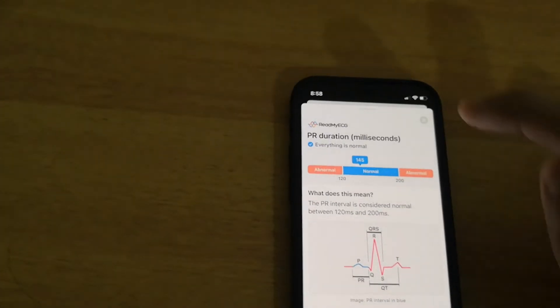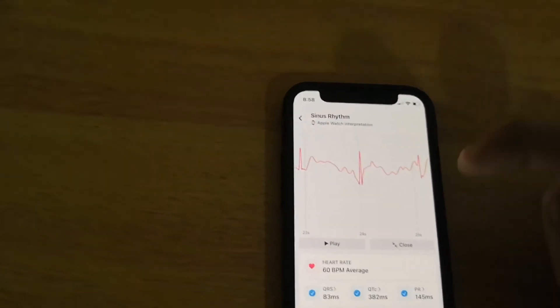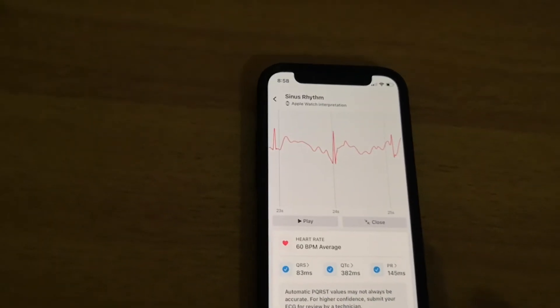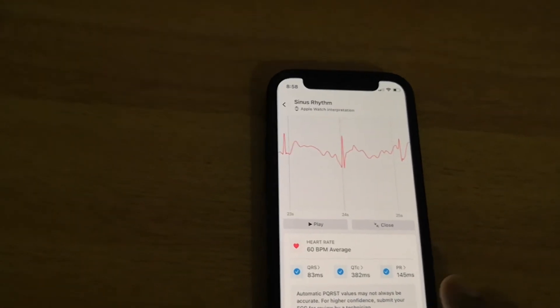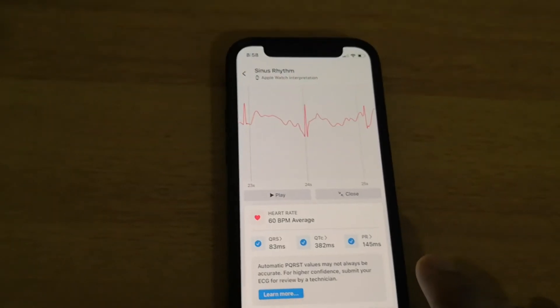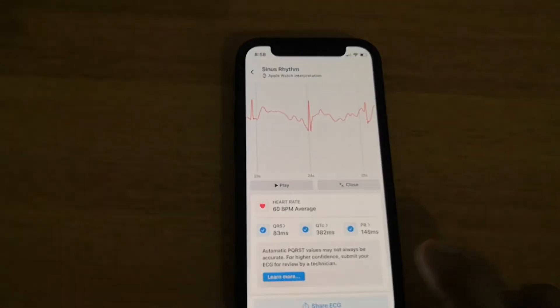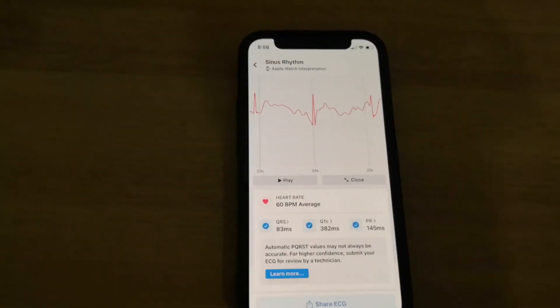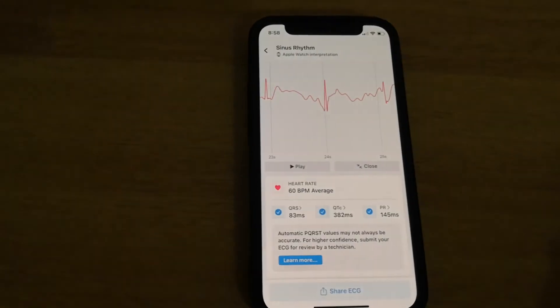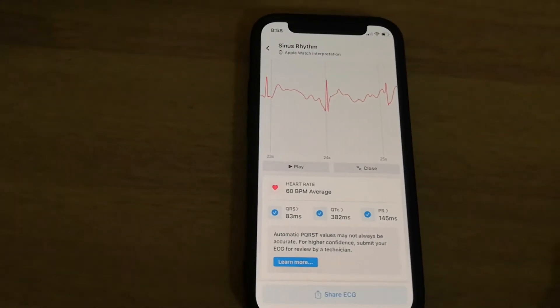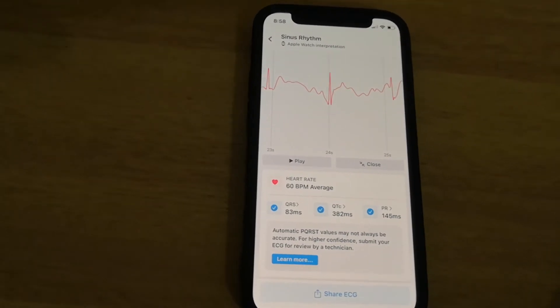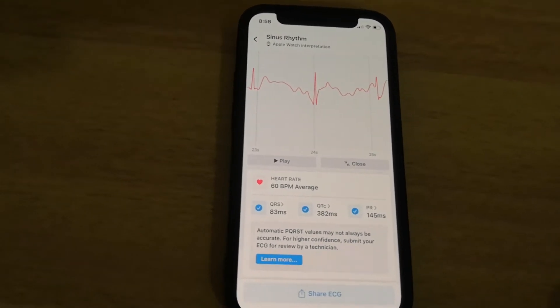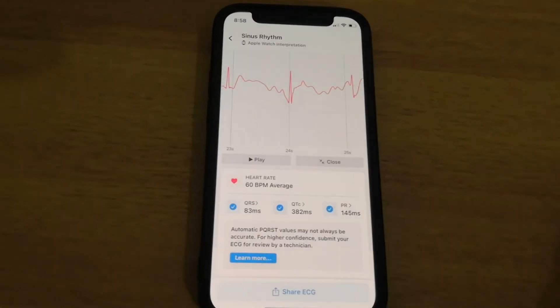From all of this, I can interpret that my ECG is normal. This is how you can check whether your ECG is normal or not. But if you are not sure about these things, you should always consult your doctor. I hope this information is useful — thank you very much.